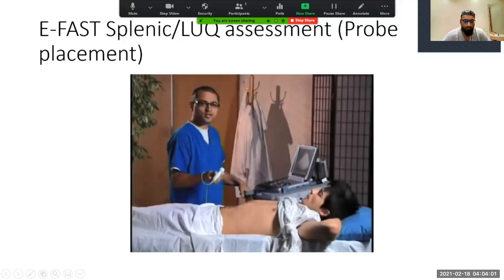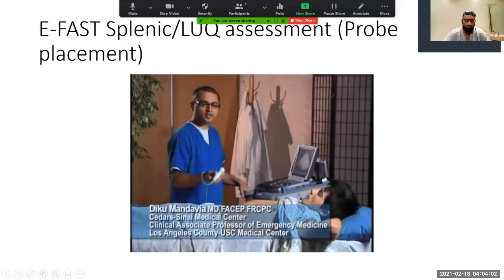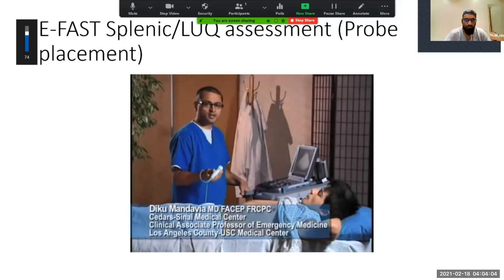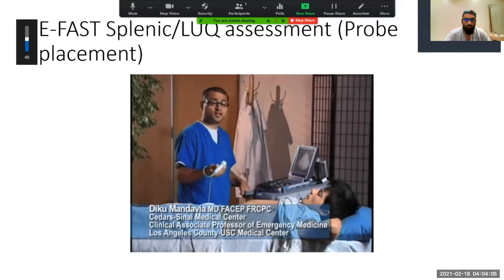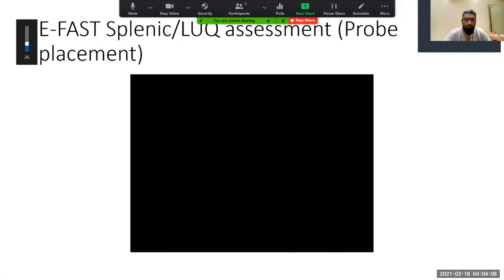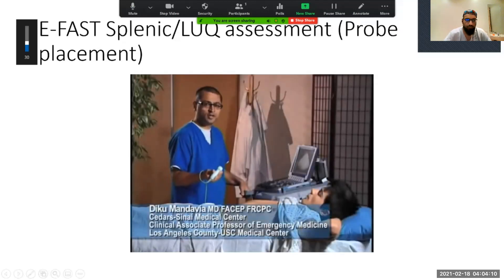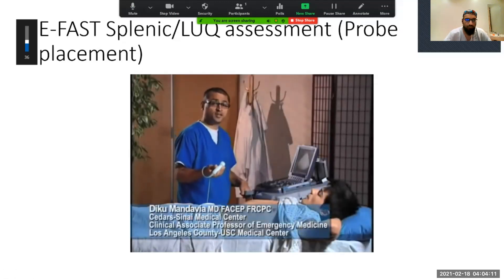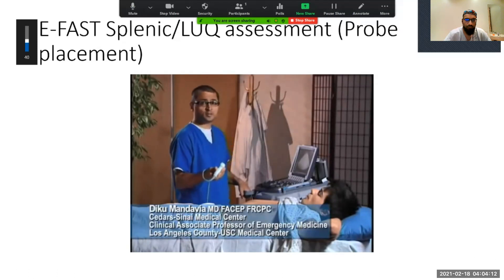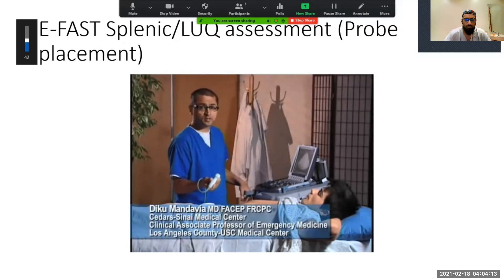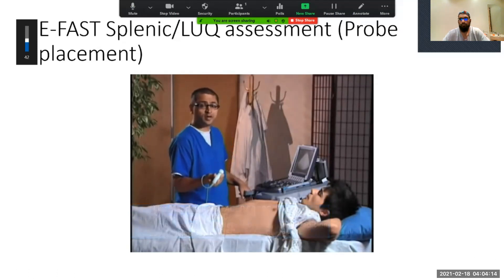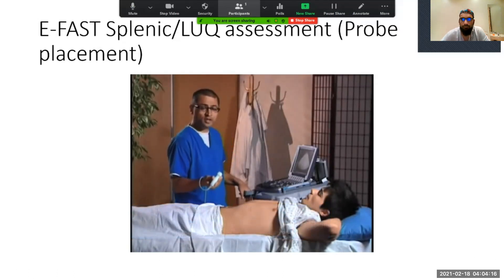The next view I'm going to take you through is the perisplenic or left upper quadrant view. This view tends to be a little bit more difficult because the spleen is smaller and doesn't provide as large an acoustic window.